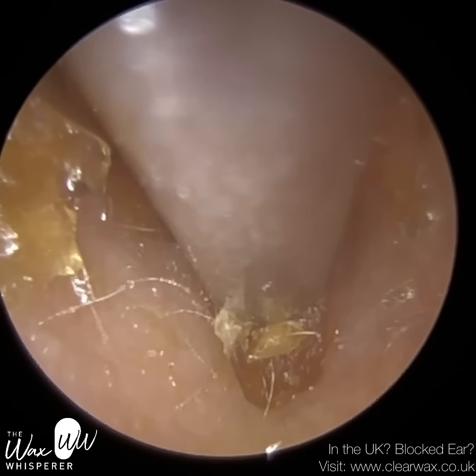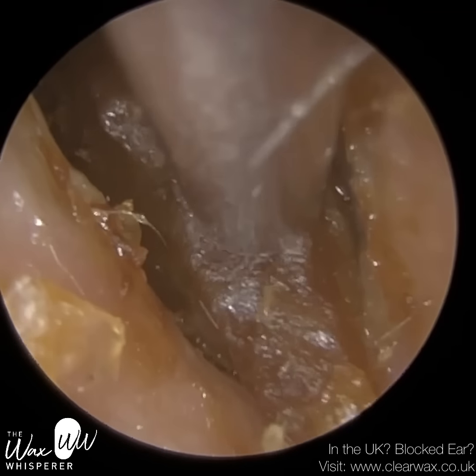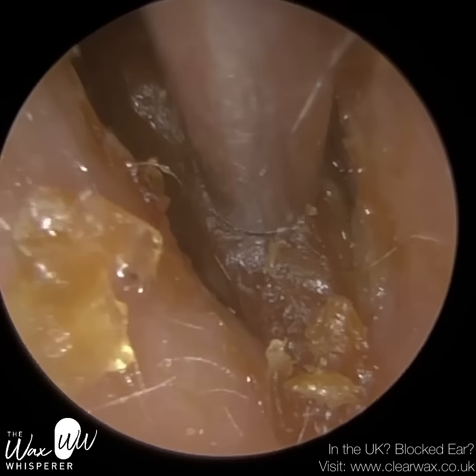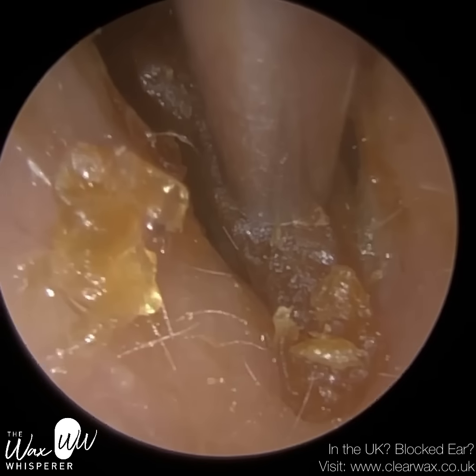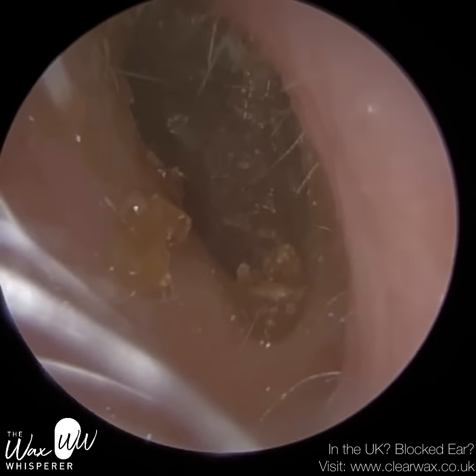I'm continuing with the microsuction, but it's still very hardened and adhered to the ear canal wall. That's why I'm making these little wriggle movements, trying to dislodge and separate the wax from the canal. I think I'm going to use an ear hook in a moment and prise this out.